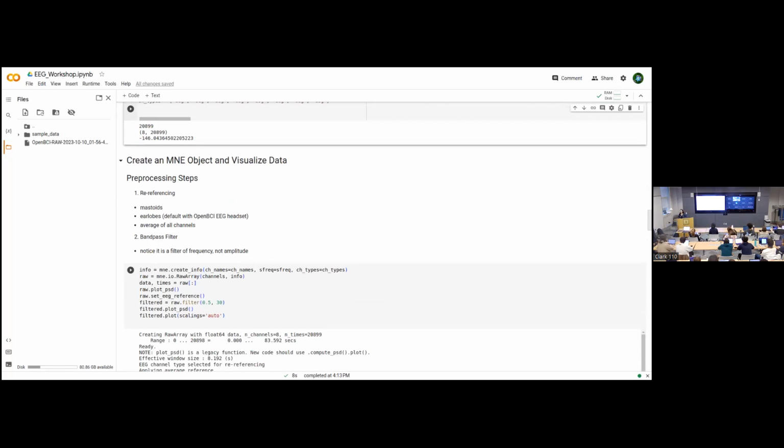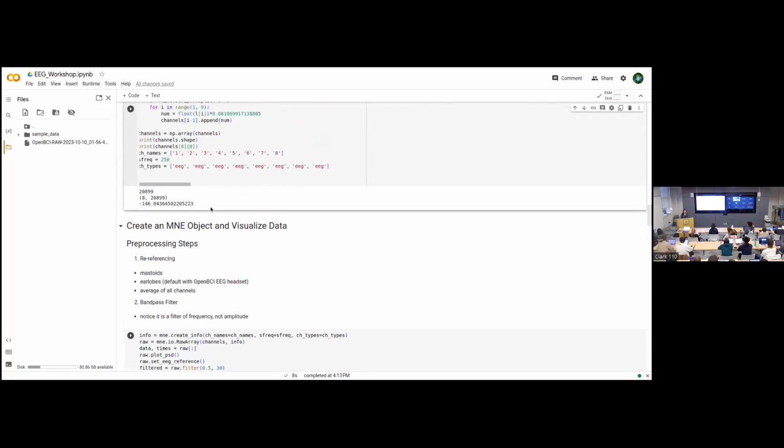Why is the first introduction? Because electrical activity can be negative. It's a fluctuation.